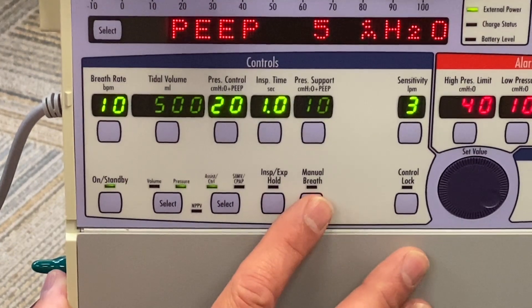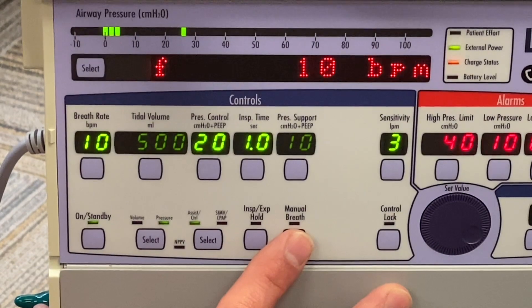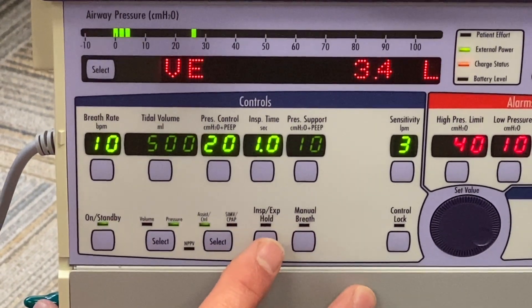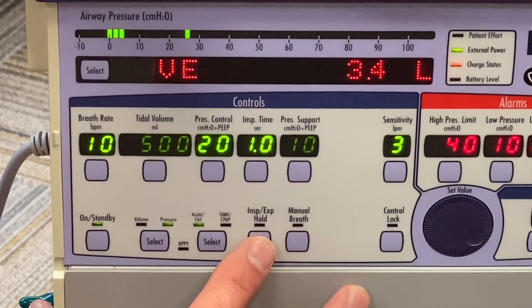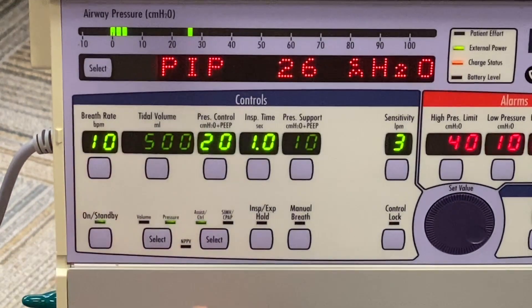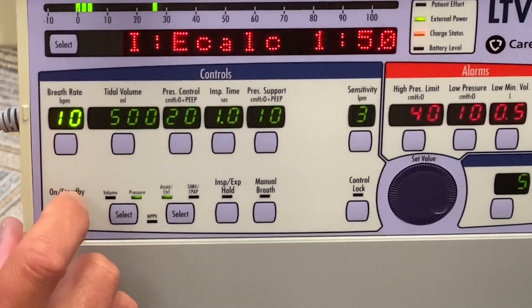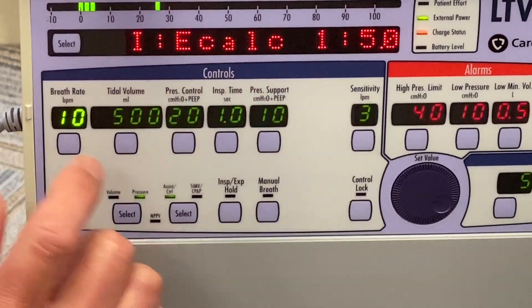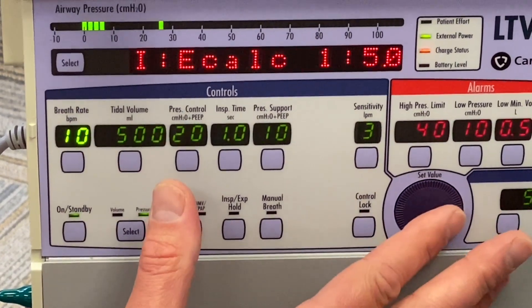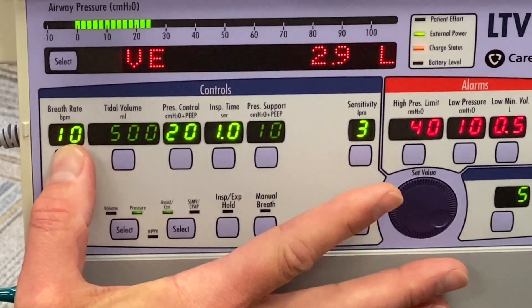Down here you have a manual breath button — exactly as it sounds: when you press it, it delivers a manual breath with the preset tidal volume. You also have an inspiratory-expiratory hold button you can utilize. Getting to your breath rate, it functions the same way as other controls: when you press it, everything goes blank except what you're controlling, and you use the toggle to make changes. Once your change is complete, you press it again.